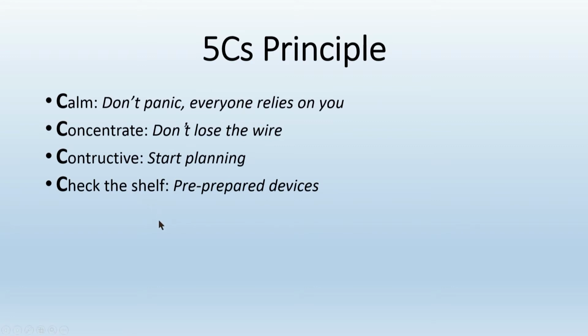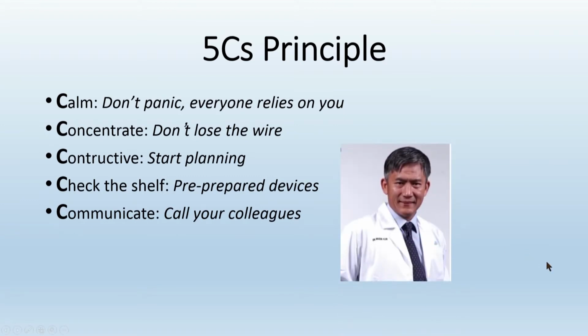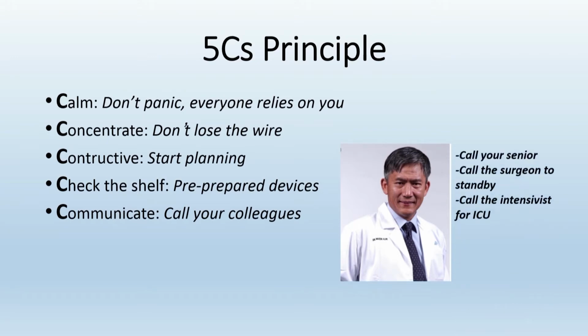And not to forget, the last C is to communicate. You have to call your colleague. Being in IJN, I have to call this guy, Dr. Alwi. I knew that he was busy in his clinic, but my call is simple: Dr. Mazni, don't go anywhere, I may need your help. Of course, I also call my surgeons to stand by in case the procedure is unsuccessful, and I call my intensivists to get an ICU bed prepared.